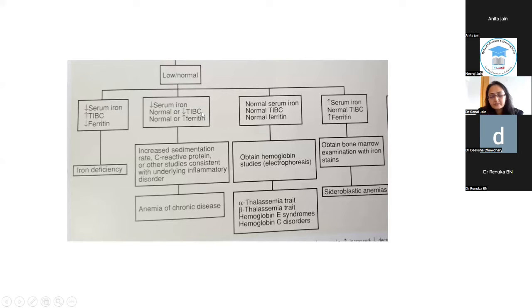And in our country, since iron deficiency is very prevalent, many patients have both of these. In these patients, even though their stores are not replete, they will respond with difficulty to the iron, because their milieu is not conducive to iron replete hematopoiesis. So it's important to pick these up. I'll discuss how to pick this up on the smears. Smears do talk a lot.